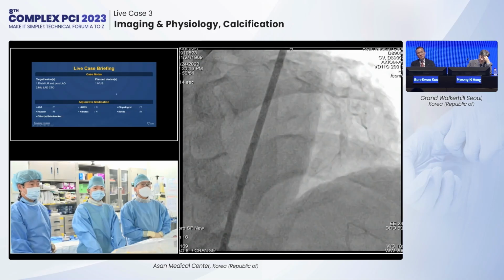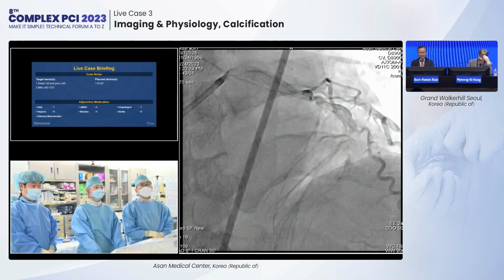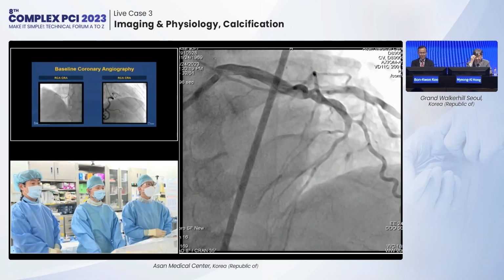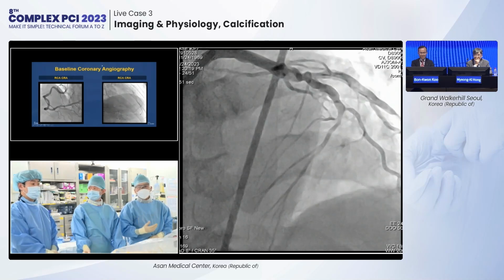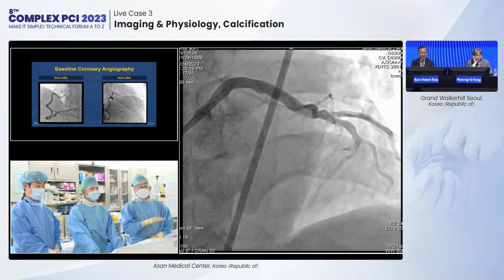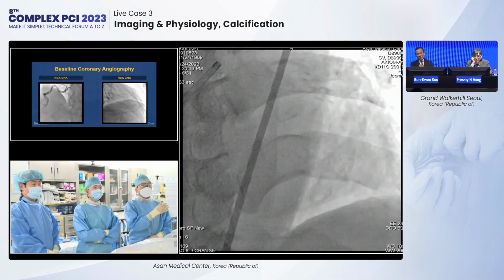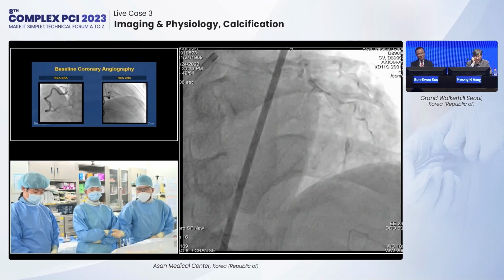A relatively young guy with significant angina that showed severe proximal LAD and distal left main disease, and also LAD CTO. Actually, the LAD CTO has good collateral from the RCA, Rentrop grade 3. We know from the DECISION-CTO trial that for a mid-LAD CTO with good collateral, medical therapy is equal to PCI. However, the patient also has left main disease, so we plan to treat both the mid-LAD CTO and the left main. Can I progress some more?